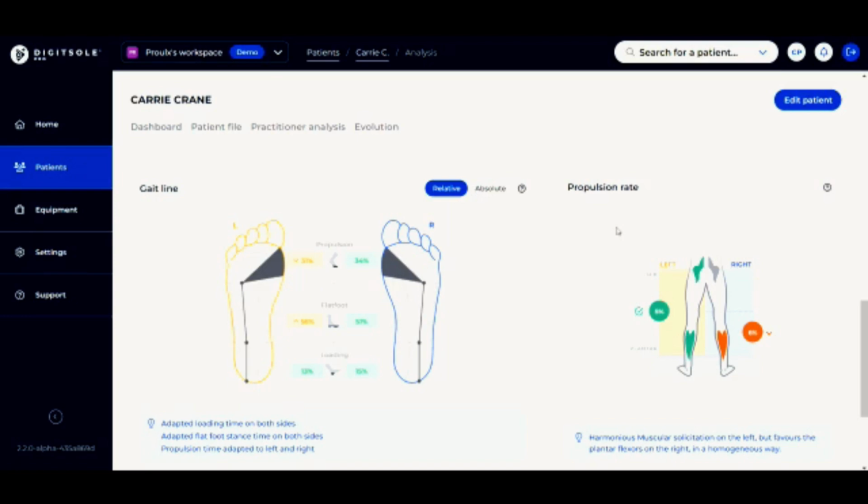Okay, so that gives us an indication as to the combination of those two and whether or not they're working appropriately. So what you'll see is it's showing us here that it's green and green, and that 5% difference is a normal value. But over here on the right, it shows that there's an absence of color here. So that means that it's not really recruiting. And then in the red, it's actually going to say that that's on the upscale or the downscale. And this is going to be indicated by the arrow, okay?